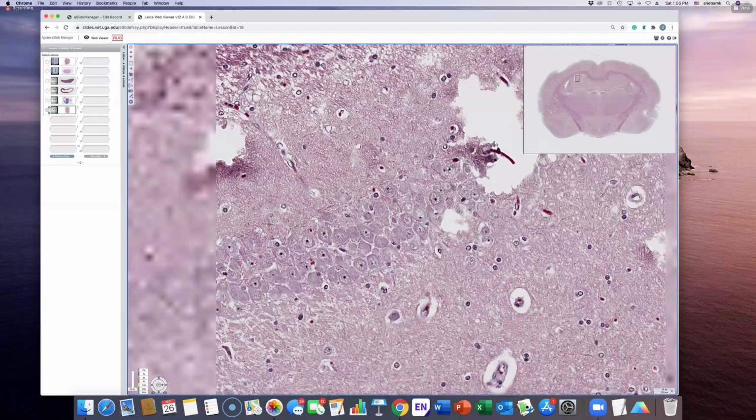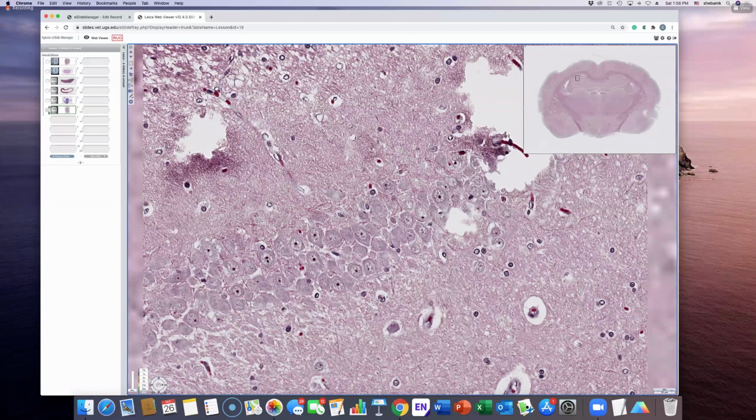They're so pretty. Is that a granular neuron? No. These are all hippocampal neurons, but let's take this individual neuron. Neuronal cell body. What is that dark structure? Nucleus. Okay, think again.